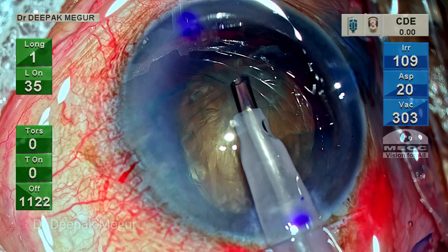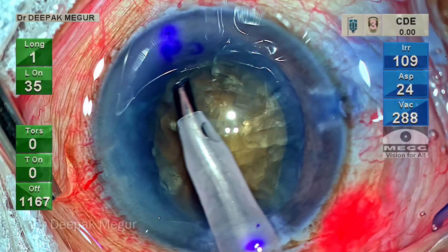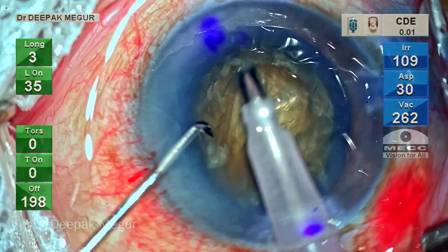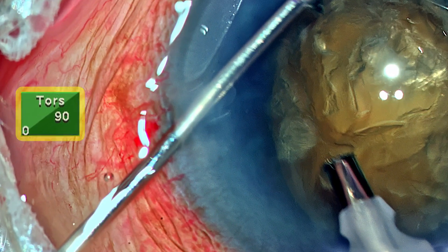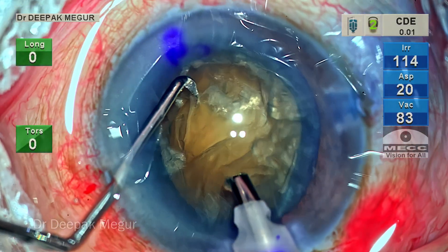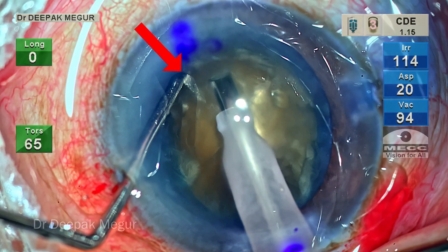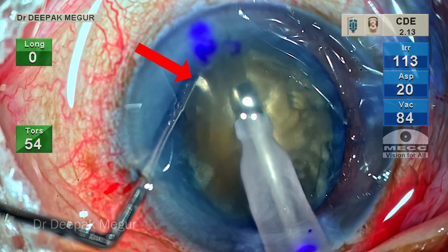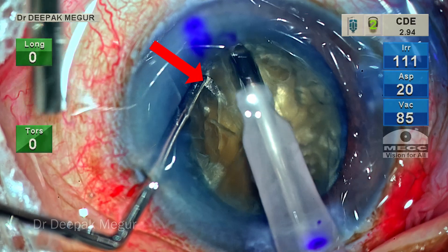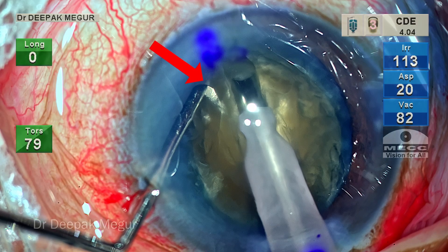I begin by using the epinucleus mode, where the power is set very low and we aspirate the superficial epinucleus and cortex. Then it's time to begin sculpting. The settings I'm using are 90% torsional power, which helps cut the lens very effectively. Watch how my left hand stabilizes the nucleus — the chopper is pressing down on the nucleus to keep it stable. As I deepen the groove, the pressure is progressively increased.